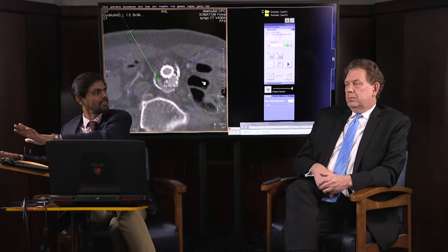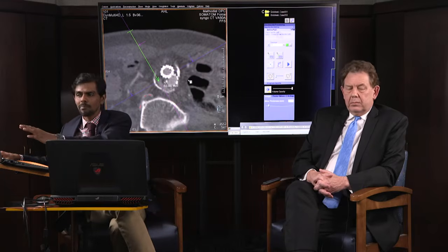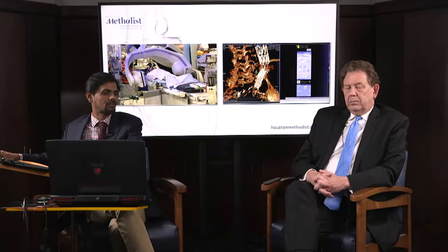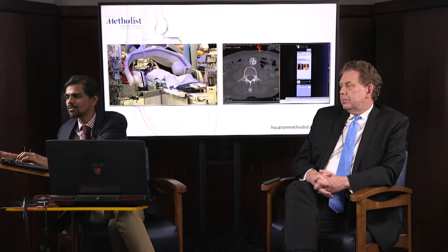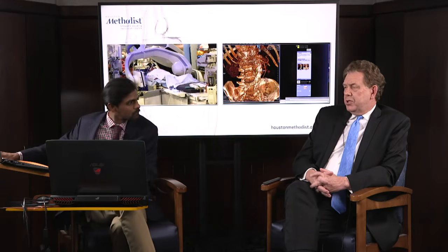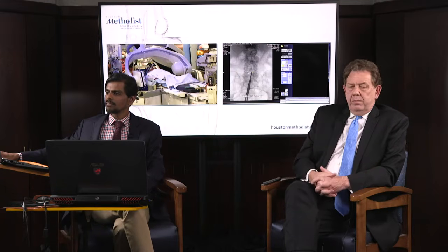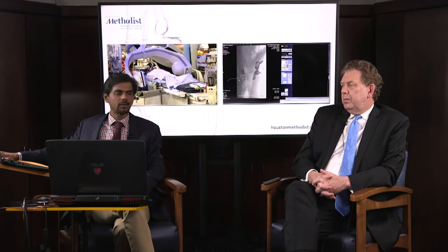Okay, so if we have both monitors up, we can show what's happening typically in the OR. This is the 3D planning software, and the other feed is going to have the live X-ray image in a second. So we planned our needle path, and these are our optimal bullseye views, which you can see is achievable, RAO 26 and 27. But we haven't really fused the patient to how the patient is lying on the table. So we are going to do the co-registration process using 2D-3D registration, as I was talking about. 2D registration is just you take X-rays in two different views. For example, here we took one X-ray image close to LAO, and the other image is close to RAO 80.